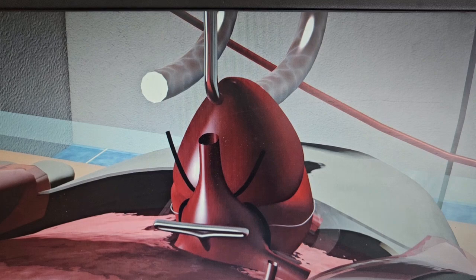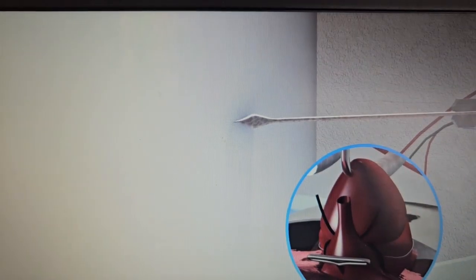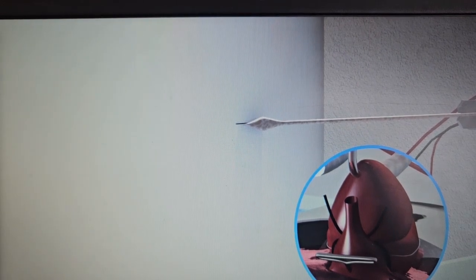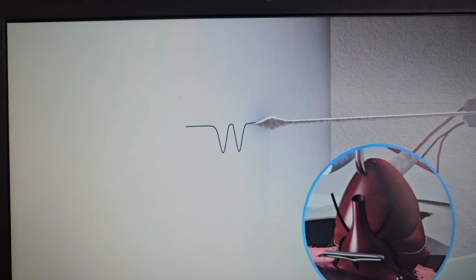After we make the heart quiescent, we apply electrodes to stimulate the ventricle. In the first scenario, we apply the first stimulus and let the ventricles contract, and then when the ventricles are completely relaxed, we apply the second stimulus. We record the resultant graph.